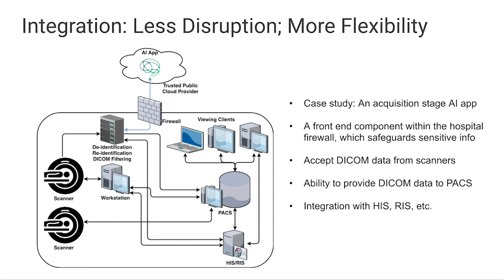usually these apps insert themselves between the scanner and PACS. That's one of the typical ways to do this. From the IT's point of view, it could serve almost as a DICOM filter. So in the sense of like you push image to that DICOM node, and after the processing is done, the DICOM node automatically pushes the processed image to PACS. And almost all the end users don't see its existence from a clinical workflow point of view.